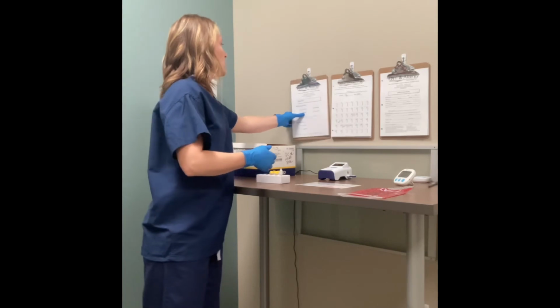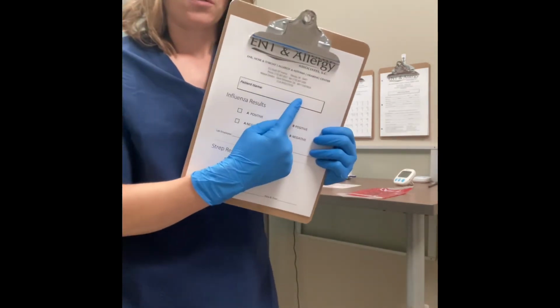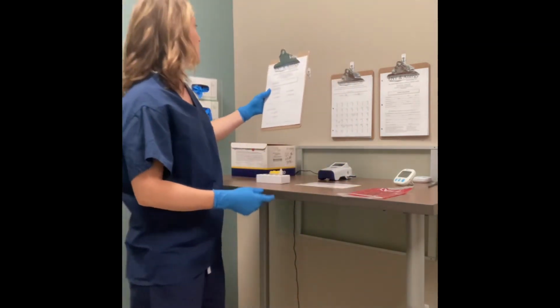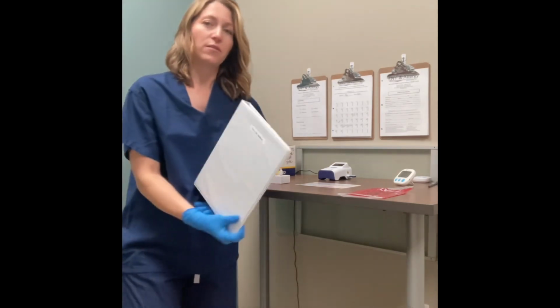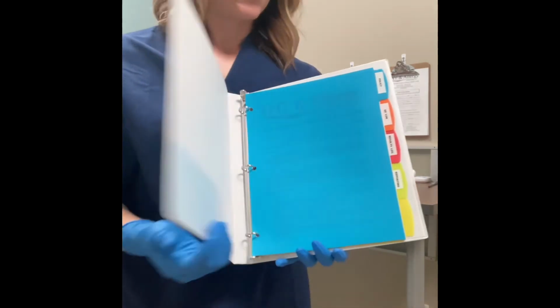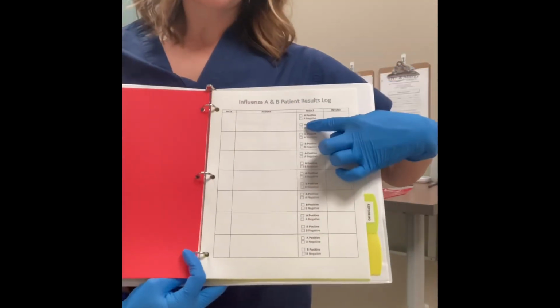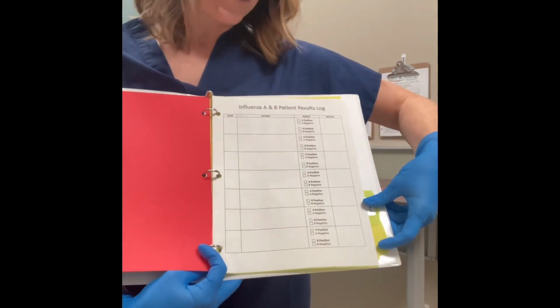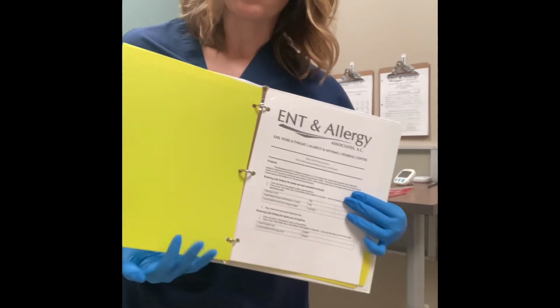So then to result it, again, you're going to go onto the patient sample and put your label here and result it, sign it and date it. This will go back to the provider. Then there's two other steps. You're going to have to go into the influenza manual and again do it on the influenza patient results log. So put a patient sticker here, result it with your initials. And then you're also going to have to go into Epic. Here's how to report it, and we'll put that report in Epic.